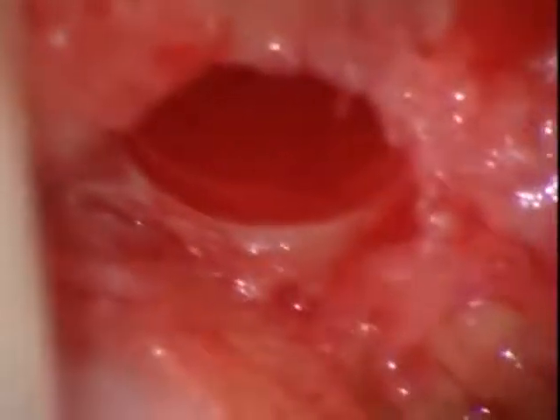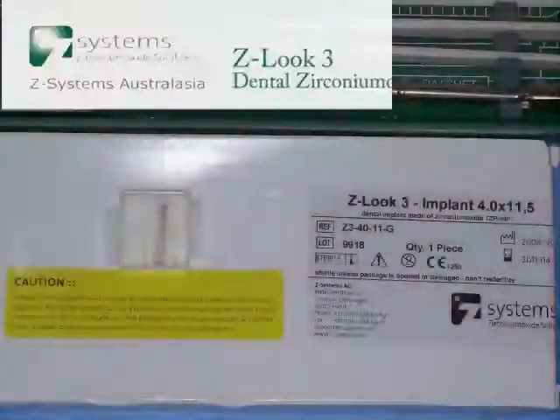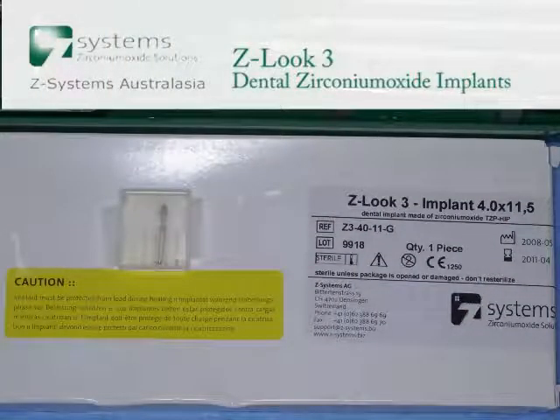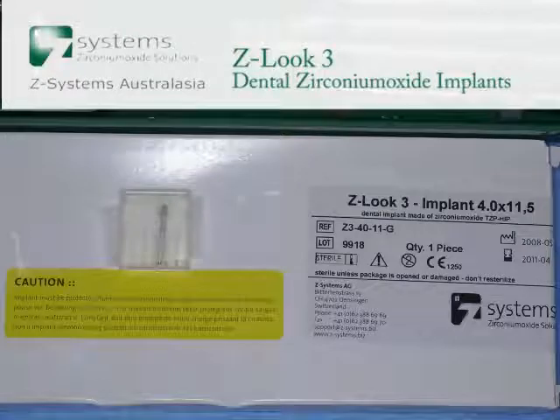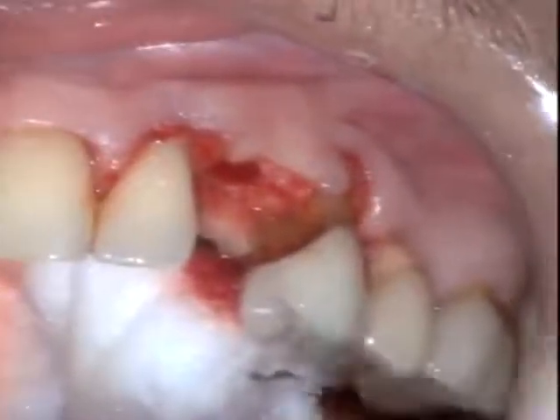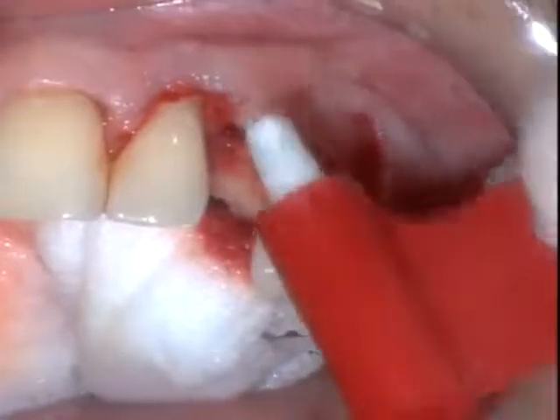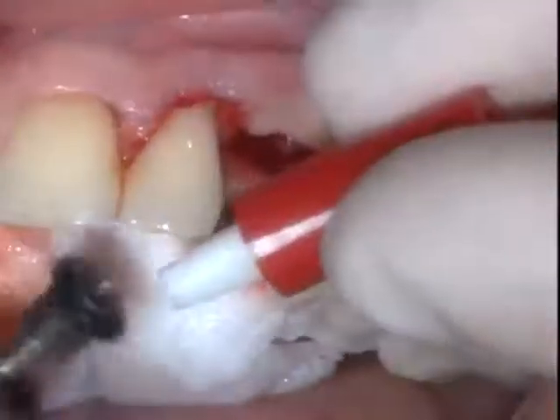This is through the microscope at 8 times magnification. Very nice bleeding crestal threads that have been etched in the bone utilizing the zirconium bone tap. The Z-Look 3 dental zirconium oxide implant system is utilized. This is FDA approved in the US. And this is the implant as it's being removed.